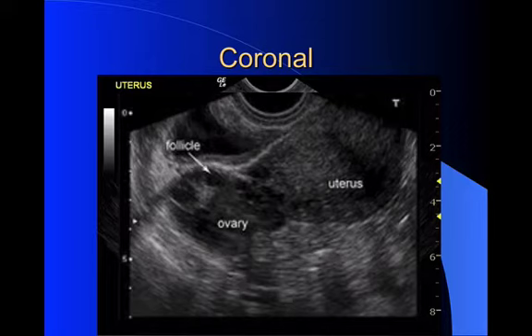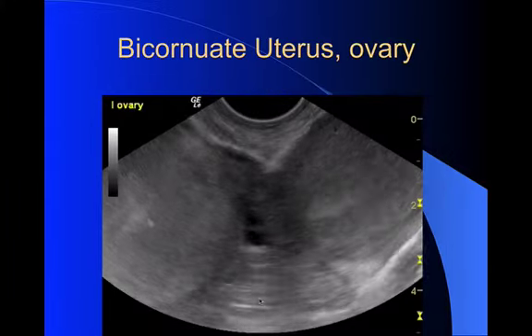We will see multiple follicles in the ovaries, and some people say they look like a chocolate chip cookie. All I know is you really have to train your eye for a hypoechoic structure. And here we see pieces of the internal iliac vein and artery.